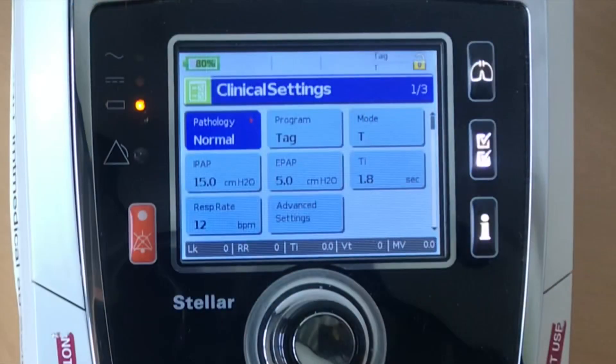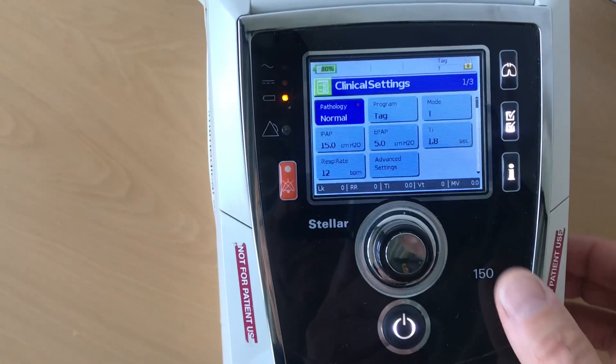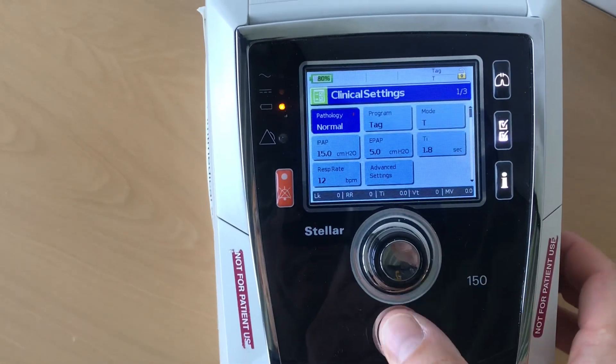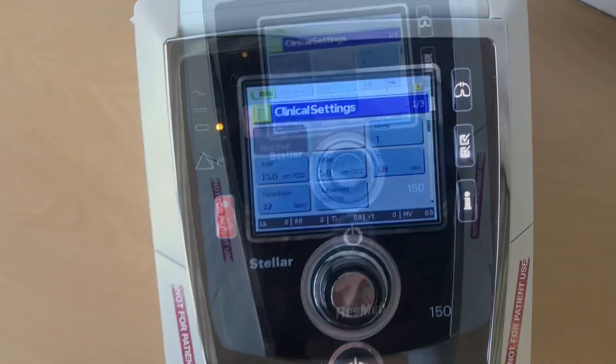In this case you can see it's an IPAP of 15, EPAP of 5, and a rate of 12. Now you want to test exactly these parameters to be sure that the ventilator is performing correctly.